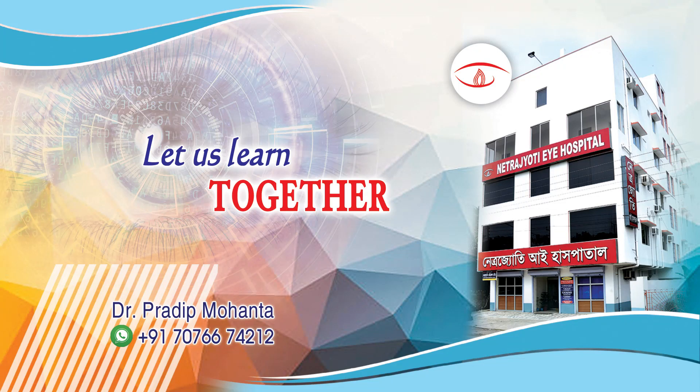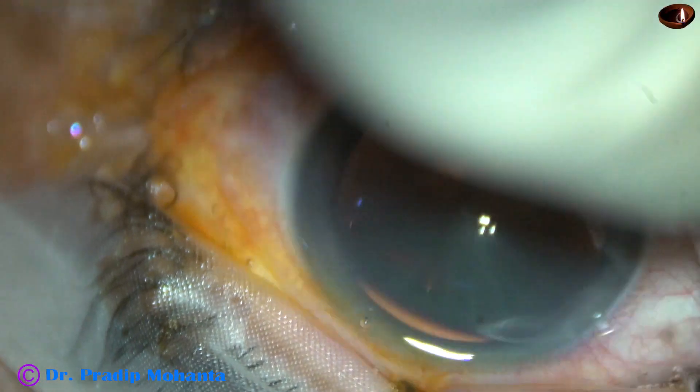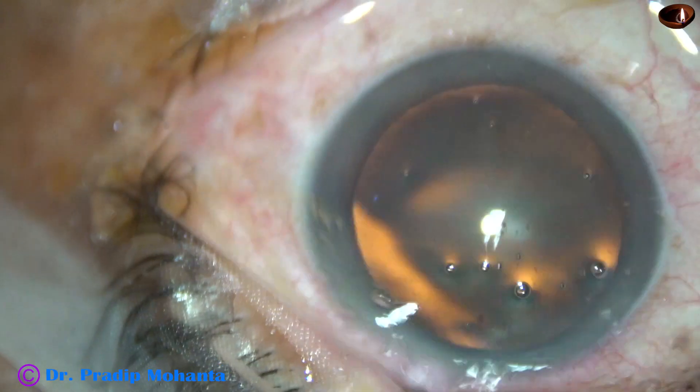Friends, welcome to my workplace at Ranak Heart, West Bengal, India. This is phacoemulsification of a soft cataract. This is a totally unedited recording. Let us observe this surgery.